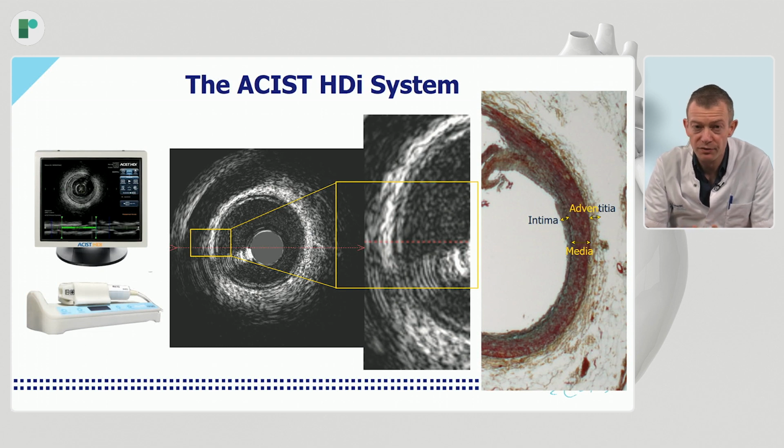So a dynamic range of 40 to 60 megahertz, allowing you both proper tissue penetration of the ultrasound signal, as well as a very high near-field resolution, helping you to better appreciate these minor details in terms of intimal thickening, dissections, etc., which really make this system very user-friendly and also somewhat more accessible for those of you who are perhaps less familiar with looking at IVUS images.